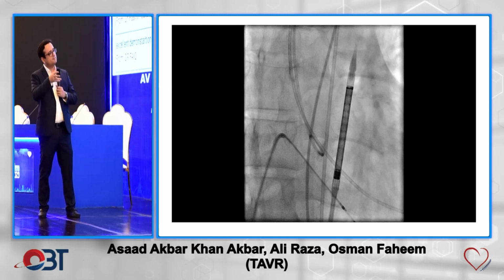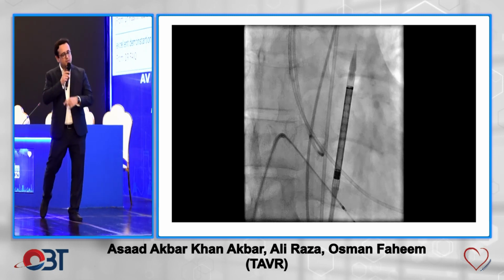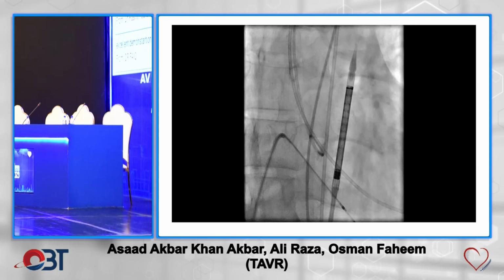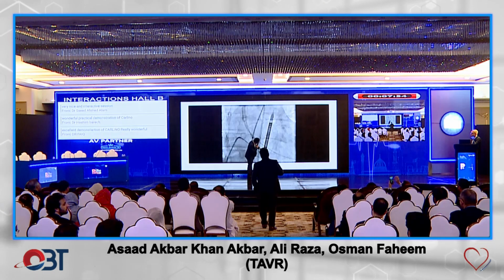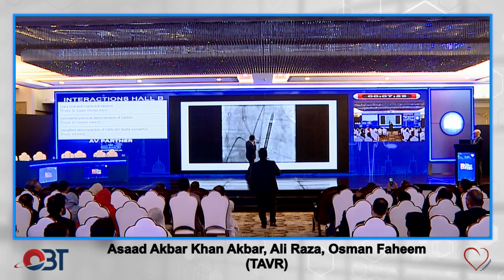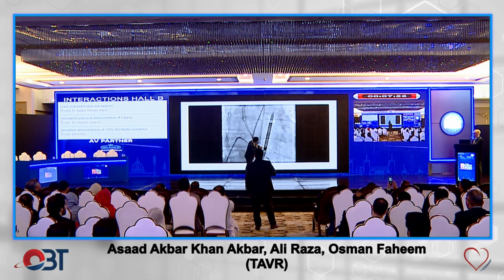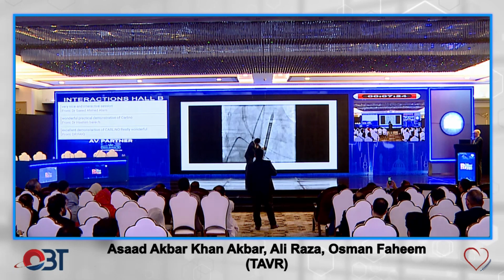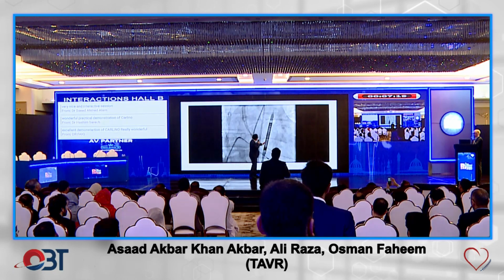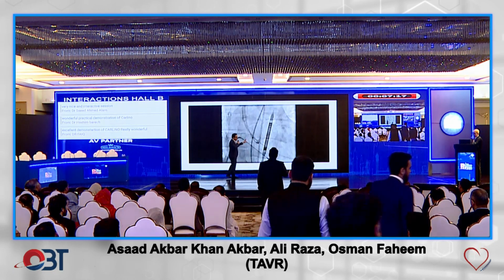So regarding loading, we were talking about it yesterday. You go on really high mag, and you make sure that the spine of your valve should not be on top of your spine. The third thing, of the 3 things that we were going to see, these are the 2 handles of the valve that you're looking at. The bottom parts of the 2 handles should be at the same height. You see a sliver of gray here and here. That's the distance between the 2 handles and the main shaft, so that should be equal. And then there should be no infolding of the valve structure.